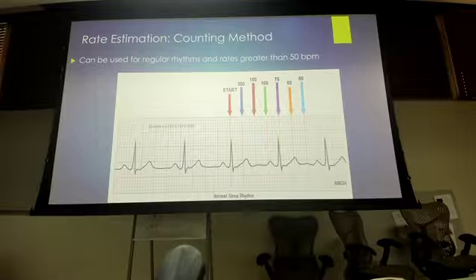We're moving fast, okay? But what can kill them even sooner is a heart rate of 400, okay? A heart rate of 20. So the first thing you want to determine is what is the rate? Do I need to be concerned about how fast or how slow this heart rate is beating? Because I may need to provide intervention right now for that rate.